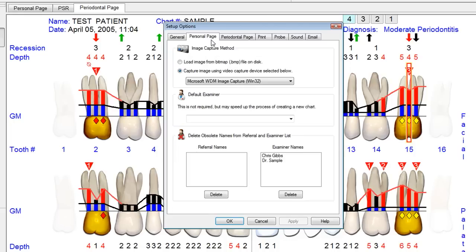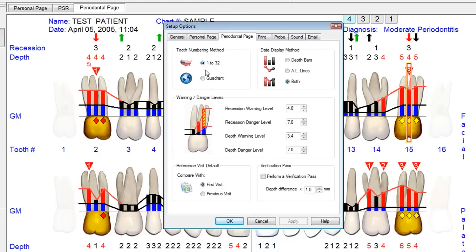On the Personal page, you can customize how you want to input images. You can also set the Default Examiner. On the Personal page, we can flip between the U.S. or International Tooth Numbering System, how we display the data, the warning and danger levels, and whether to automatically compare to either the first visit or the most recent visit.